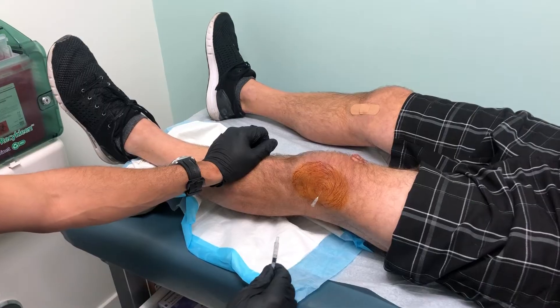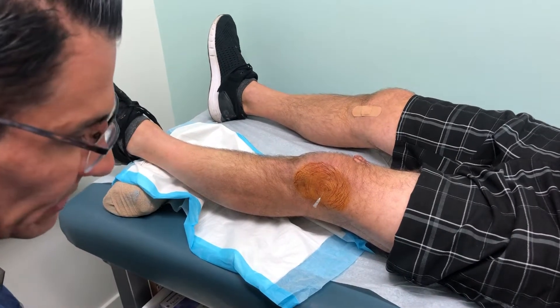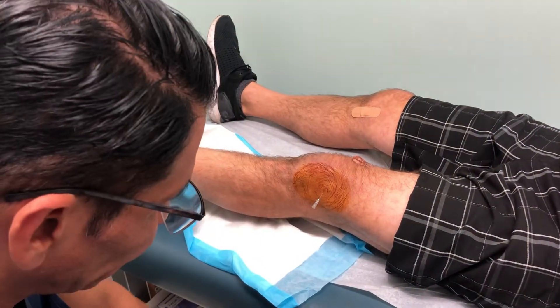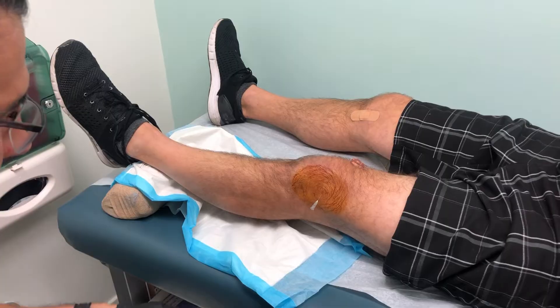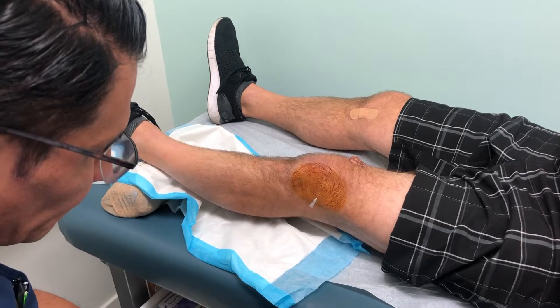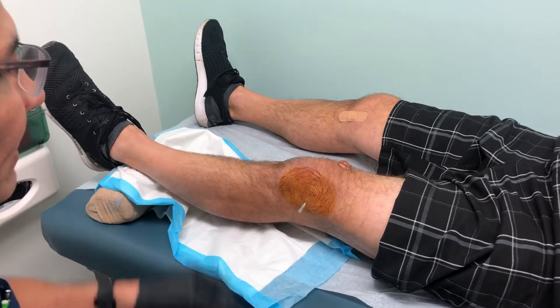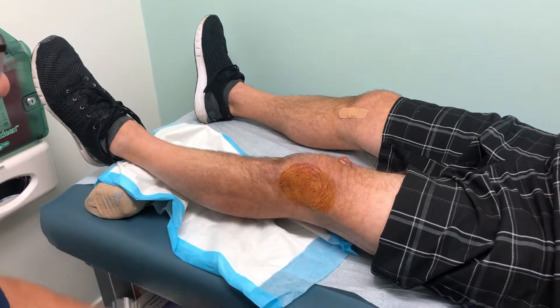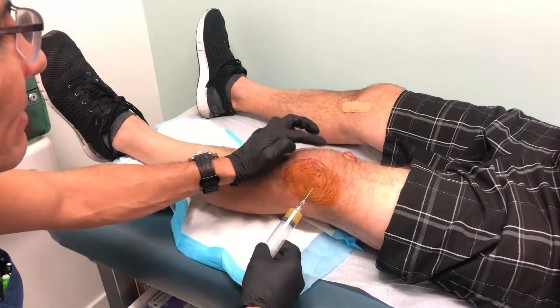Now I'm going to focus here. I left a needle right there for a second. What I'm going to do is take the platelet-rich plasma and put it on a 22-gauge needle. I'm going to put it on the needle. And then I take this needle out. I keep my trajectory in mind — I know it's going to be right here. A little poke, okay Steve? You're doing great.